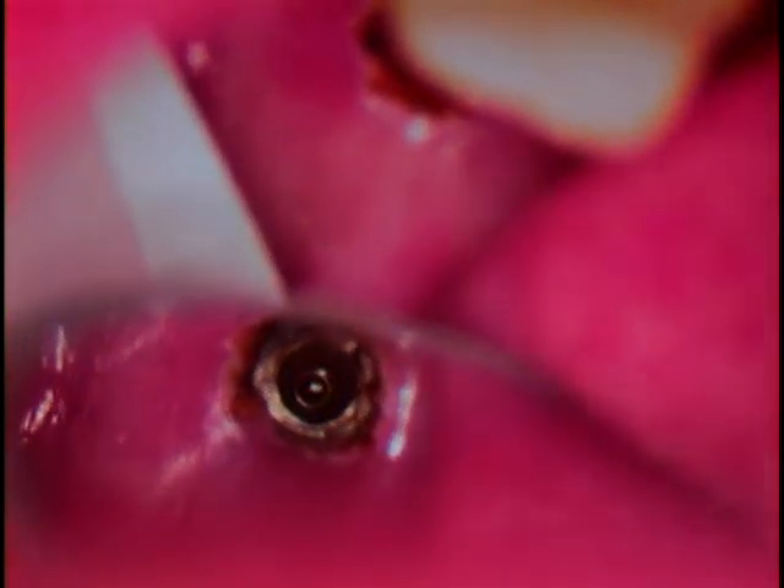Tooth number position is 18. This is a fractured tie base abutment. If we look at the diameter of the tie base component that's in the crown, we're going to show you how much thickness the walls have. If you're doing a tie base case, there is the actual thickness — definitely less than a millimeter. It has a certain vertical height; no problem with the vertical height, it's more of the horizontal thickness that was the problem. You can also see a flat end for anti-rotation, and so that's even thinner at that point.